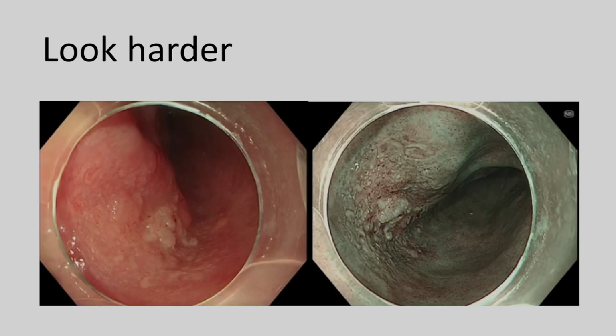What about this guy? This is a really nice pickup on a diagnostic procedure. So this is a wide area of abnormal squamous mucosa with central slough. Then we moved on. I did narrowband imaging. If you can see, focus on this area, everybody can focus on this area here, right in the center. But what's happening in the north of this polyp is something which we need to focus on.